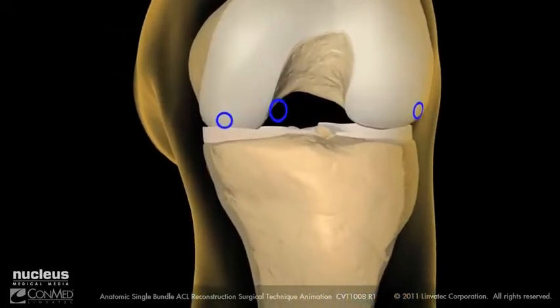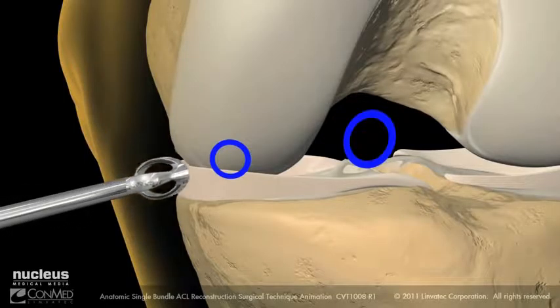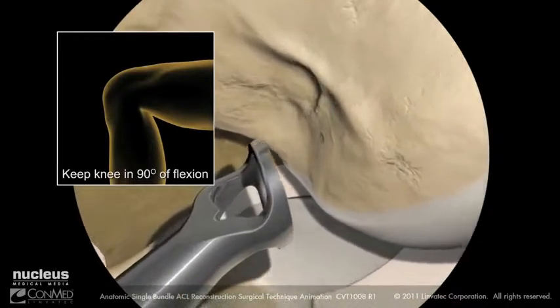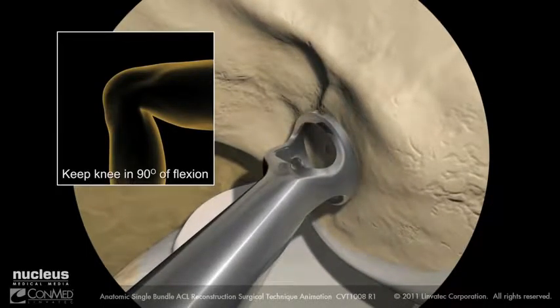With the ACL footprint identified and the center marked, insert the bullseye femoral footprint guide into the accessory anteromedial portal with the knee flexed at 90 degrees. Place the guide at the center of the ACL footprint. Once the correct position is achieved, advance the guide pin into the femur a few millimeters to notch the bone. Back the guide pin out to check that it correlates to the mark you made earlier in the center of the footprint.